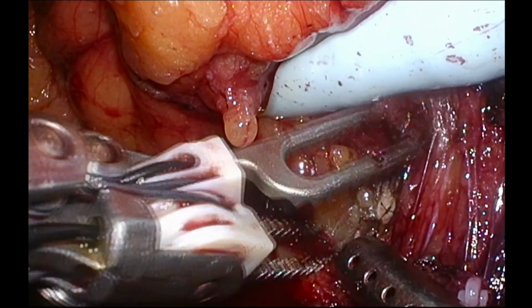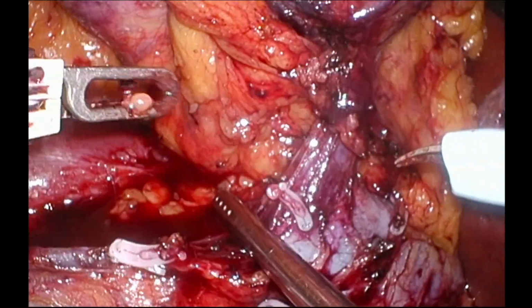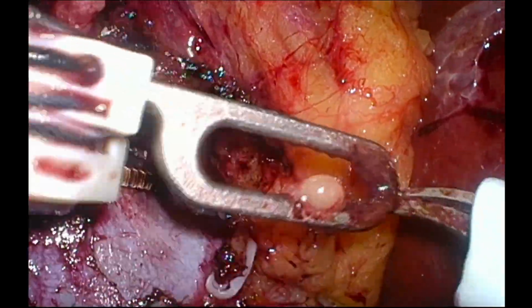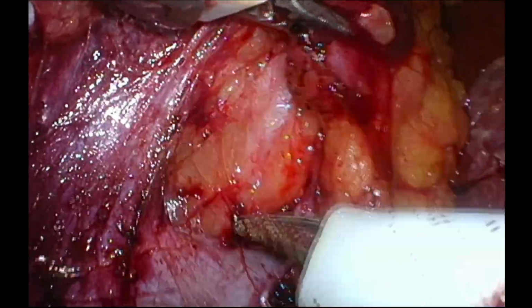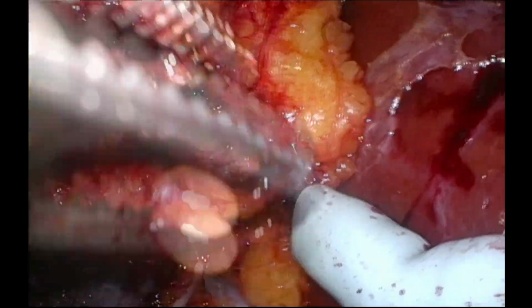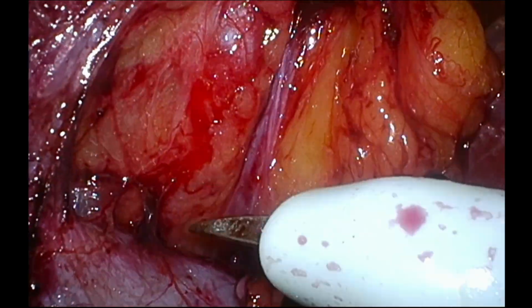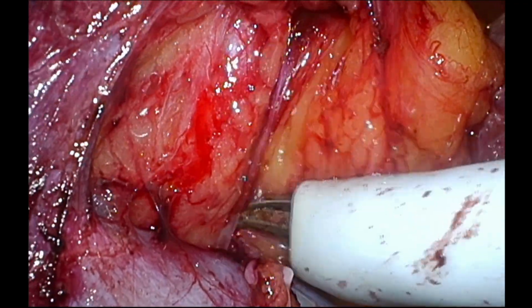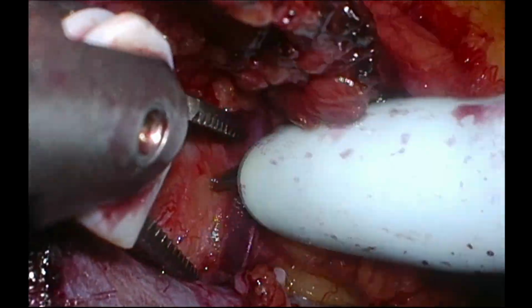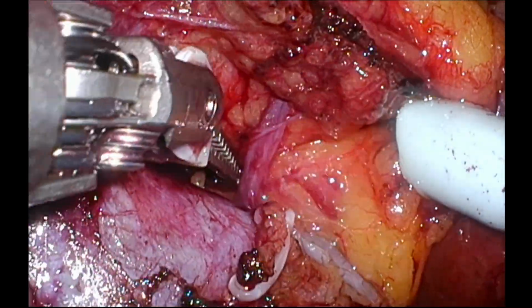Renal hilum is the most critical structure. It contains renal artery, renal vein and renal sinus fat. Dissection at the renal hilum should be very gentle, should be meticulous, and the movement of the instrument should be along the axis of the vessels. Any tubular structures near the renal hilum should be considered as potential renal hilar vessels and need to be dissected well before dealing with it.